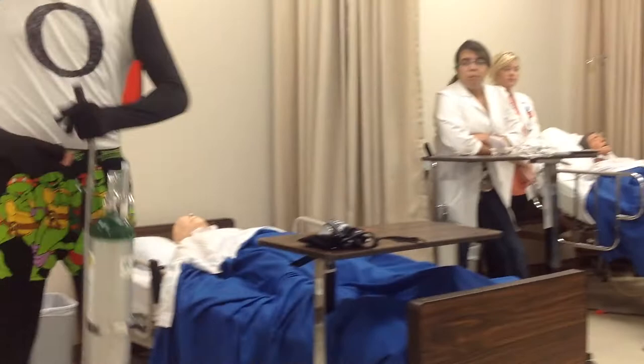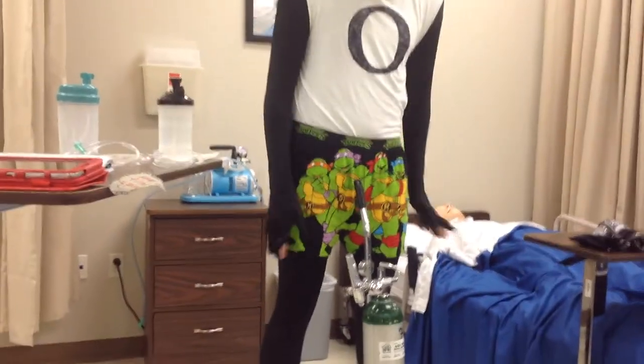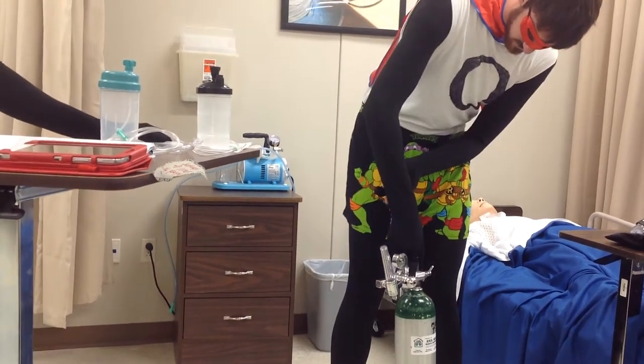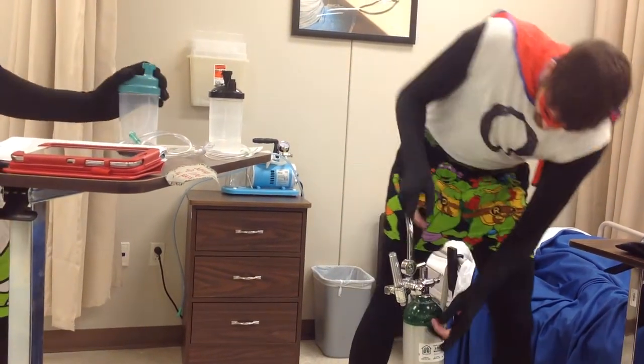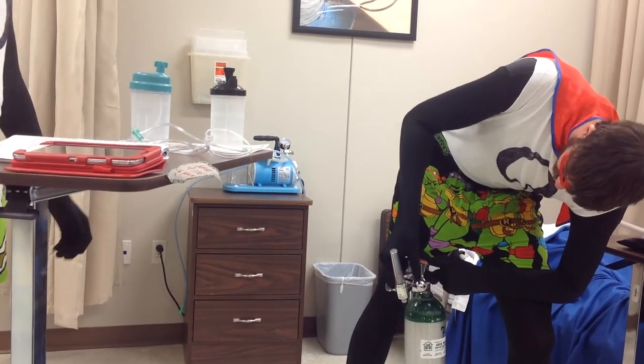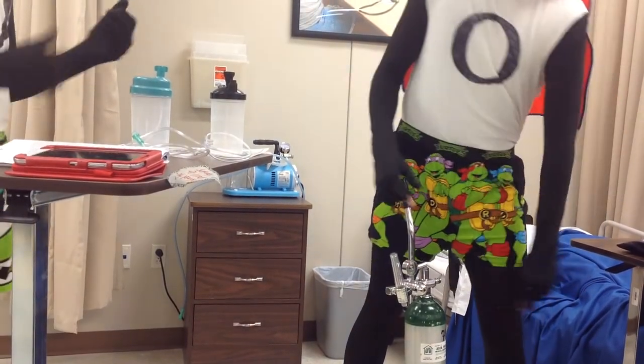Once you put on your regulator, you want to make sure that the regulator is working, so you're going to turn on your oxygen. You also want to make sure there's actually oxygen in the tank because obviously it's no use if you don't have any. Then you just open it.